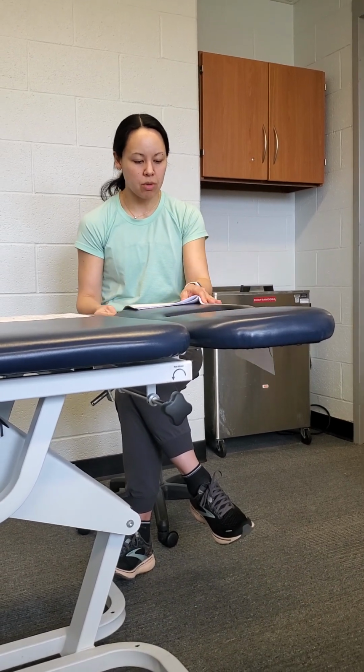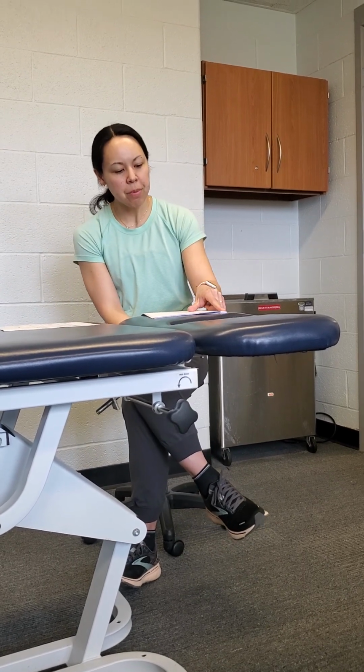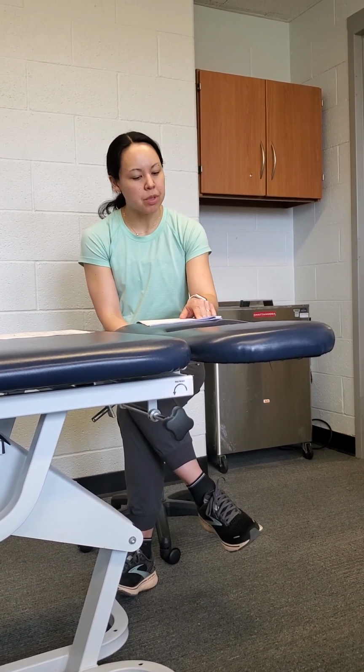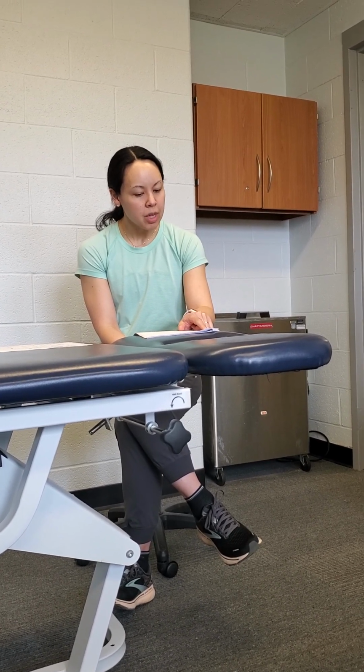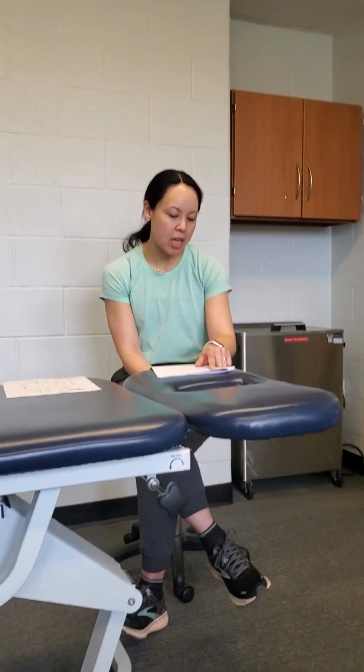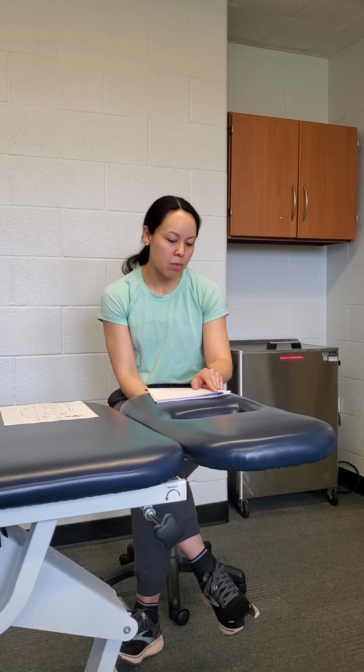And then if we flip over to aerobic BFR, the intensity with the BFR is typically less than 50% of their VO2 max or their heart rate reserve, and the pressure is a little bit lower, so you can do 40 to 80% limb occlusion pressure. Duration is just kind of continuous, while they're on the bike or the arm bike, 5 to 20 minutes. It could even be your whole treatment for that day potentially, and you would do this for about a span of 6 to 8 weeks.